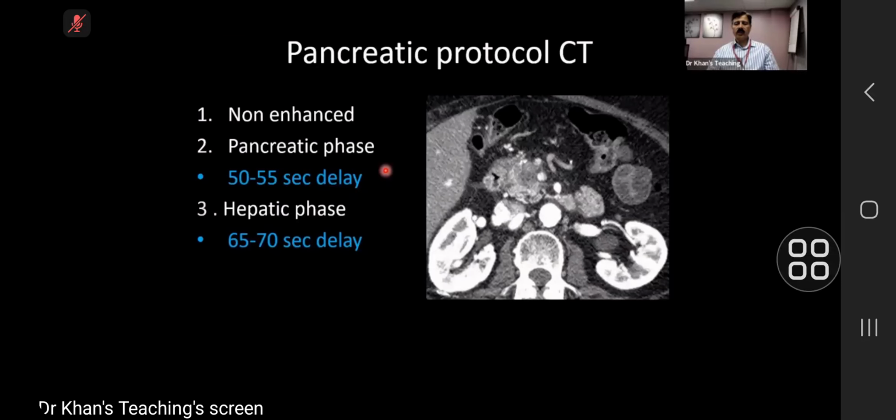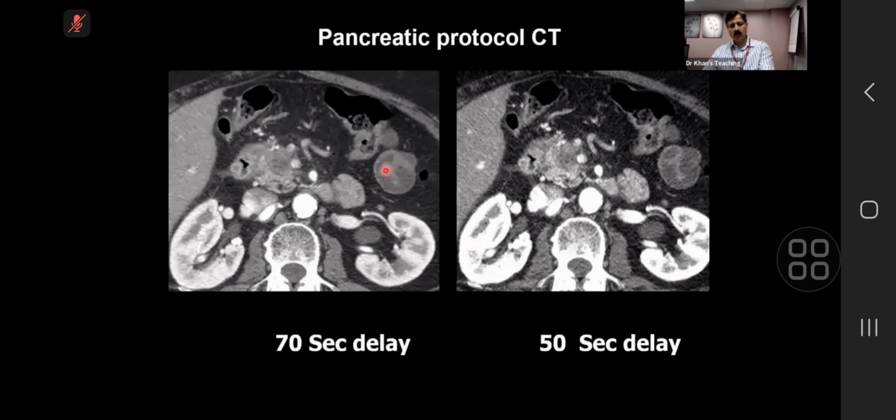Question. When you do TNM staging, for T staging, endoscopic ultrasound is routinely done. In pancreas, it's slightly different. You don't have to do an endoscopic ultrasound to do T staging, which I'm going to teach you on CT. On the other hand, if a tumor is not visible, endoscopic ultrasound is much better, and of course you can do a biopsy with it also.